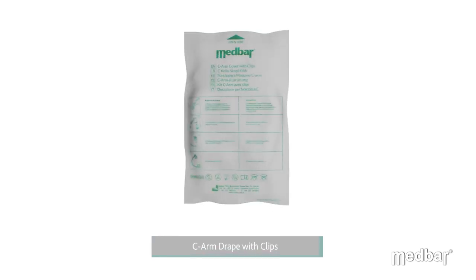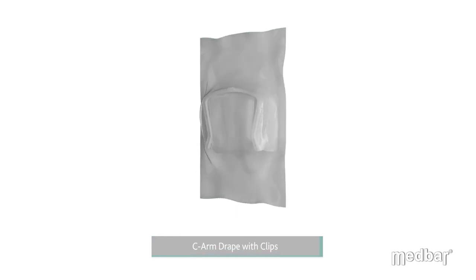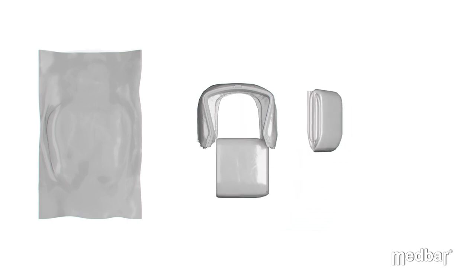Medbar presents the C-Arm Drape with Clips Pack. Each pack consists of two fluoroscopy drapes and one C-Arm Drape with six universal clips attached to the drape.